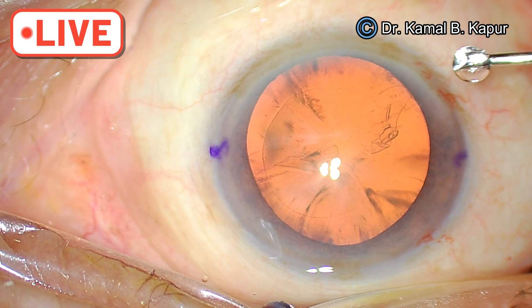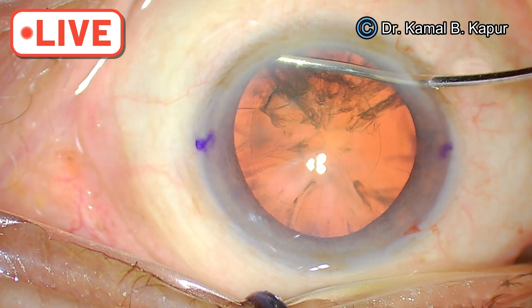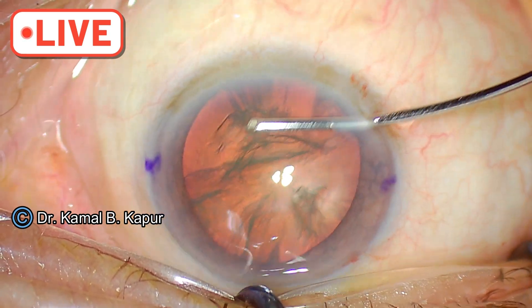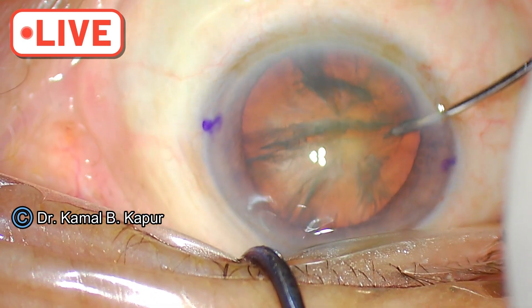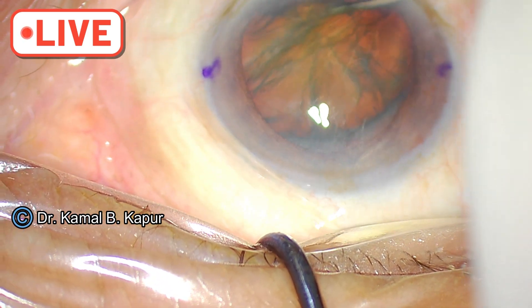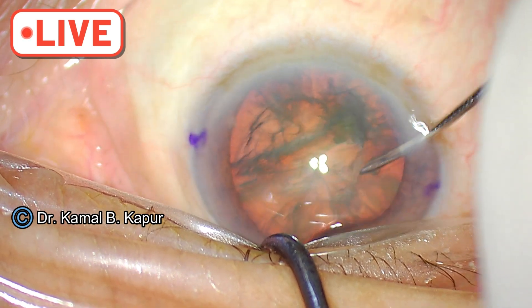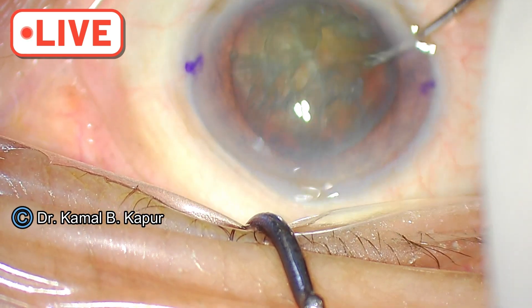We have already done the rhexis — the recording started a bit late. So we will proceed with the cortical cleaving hydrodissection. This is a special cannula designed by me — a curved cannula with a blunt edge, 23 gauge. The AC is shallow as the patient is hypermetropic. The cataract will resist dialing; in case it doesn't dial, we can use bi-manual dialing. But yes, it is dialing now.